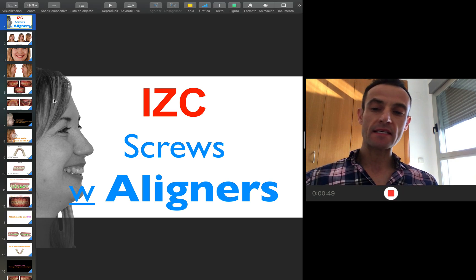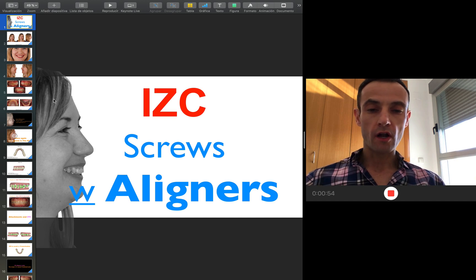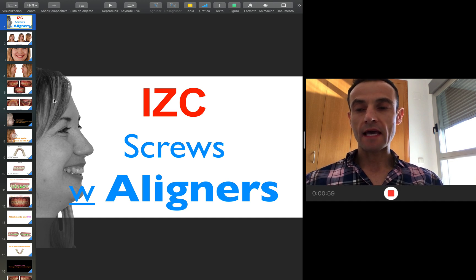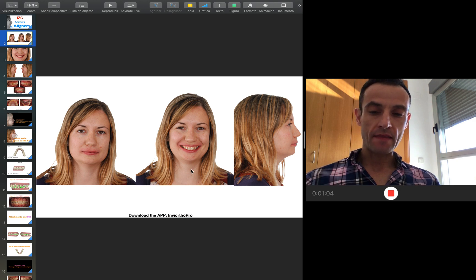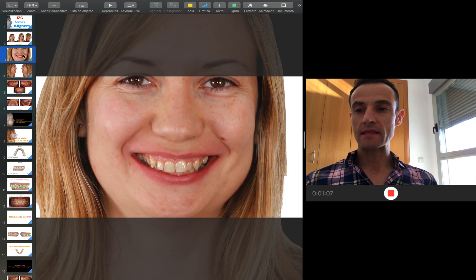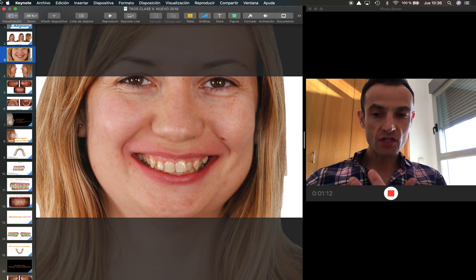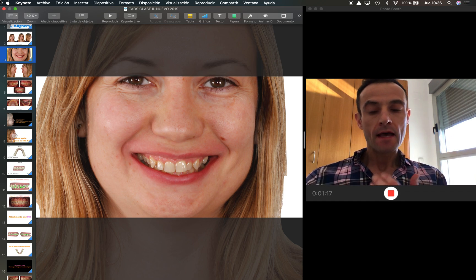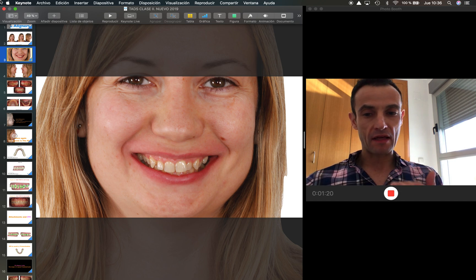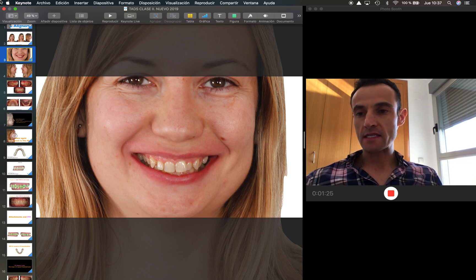The idea of this case is I use infrazygomatic screws to solve a severe problem of deep bite and Class 2, because as you can see here in the pictures, look at the narrow smile that this woman presented. The idea here was to improve and give her a wider arch, also modify the torque on the back to give her a full mouth smile and intrude the frontal teeth a little bit, giving her more top front canines to the back in order to improve this position.